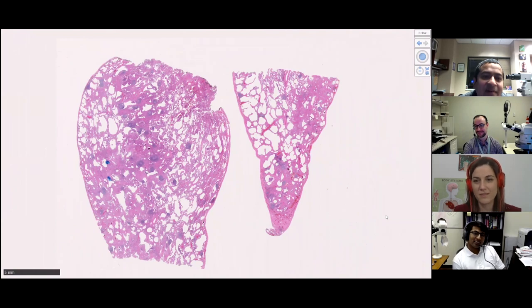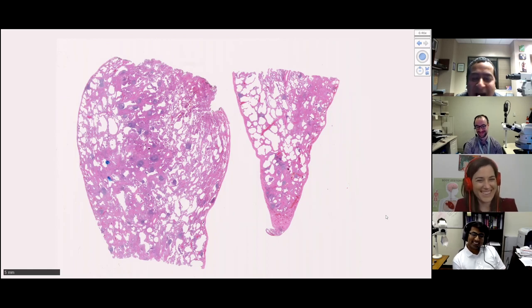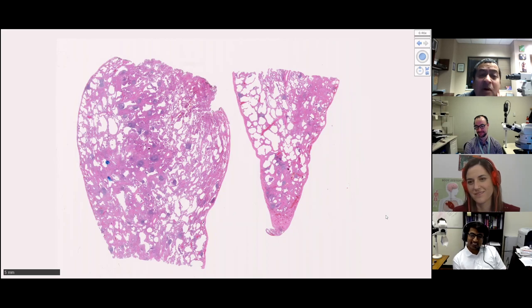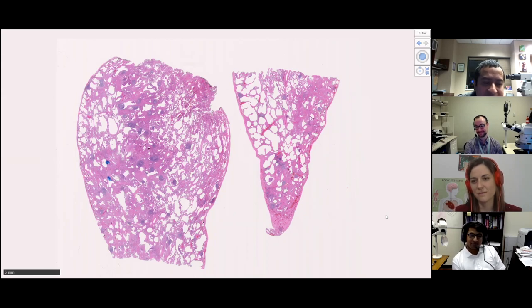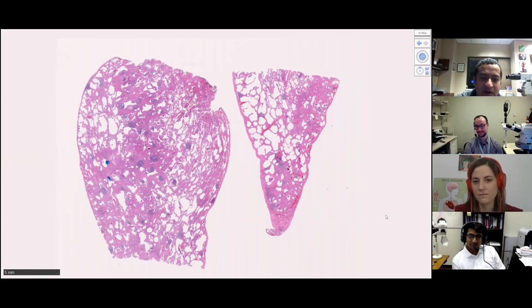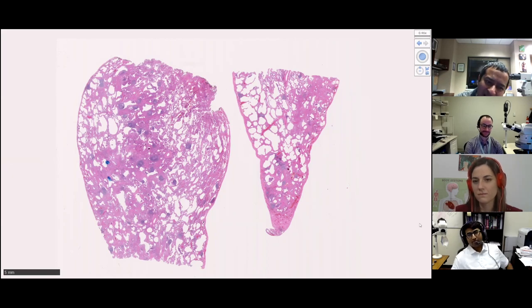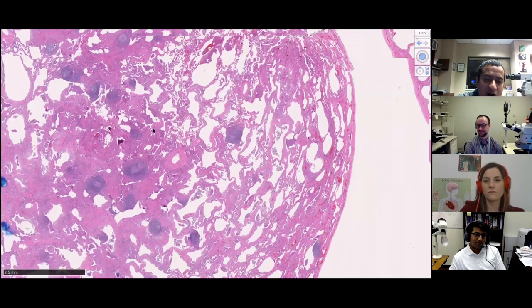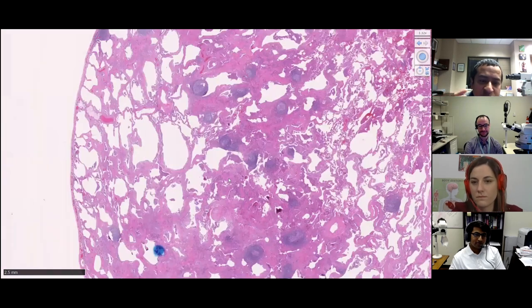Not UIP. Not UIP. Complete consensus between three - absolutely not UIP. This is almost diffuse. This brings up a very interesting point about NSIP that people ask: how much spared lung can you have? How diffuse does it need to be? Can you have a little bit of spared lung? Usually I think you really shouldn't have much spared lung, but a little bit of variation in thickening is acceptable. In the subpleural areas it gets slightly less, and slightly more in the middle.